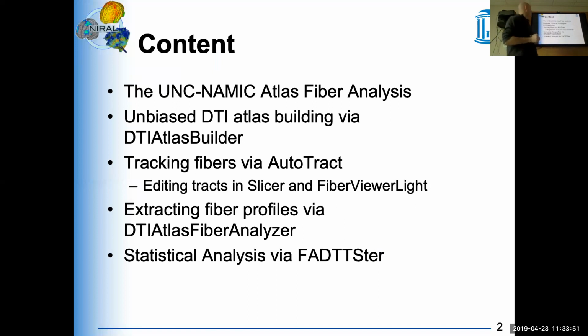There's another more atlas-based fiber analysis methodology that comes out of the LONI, which is at the University of Southern California. And it's a pretty decent one. The thing that they're missing is an analysis along the tract. But they do something actually quite similar to what we're doing: you build an atlas and you do tractography, in that case, automatic tractography in the atlas as a way to get to regions.